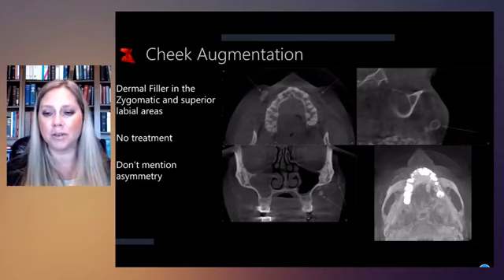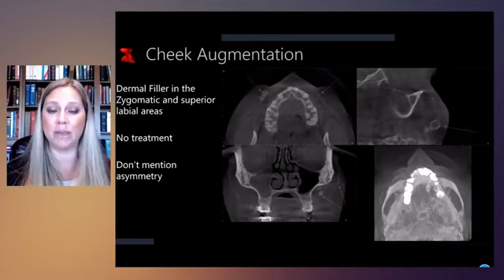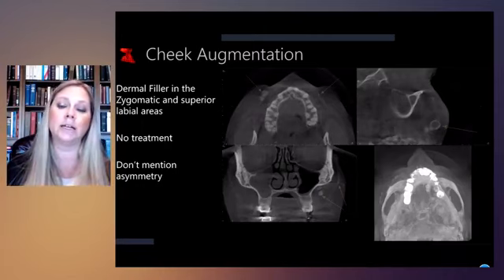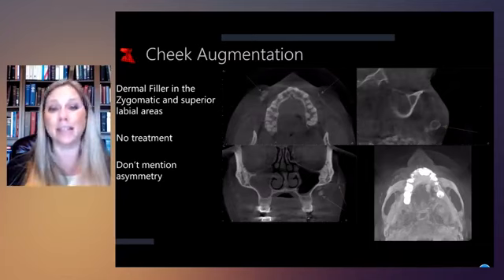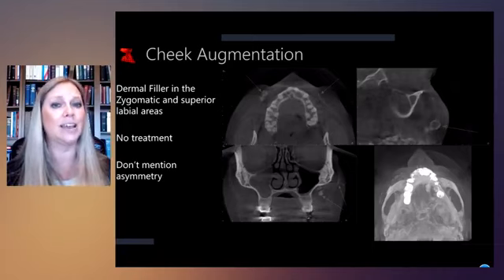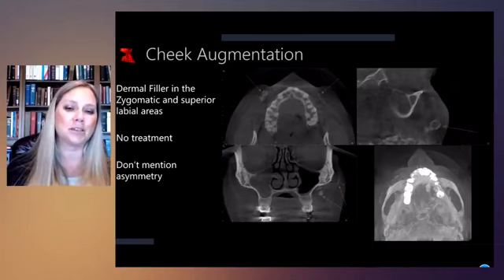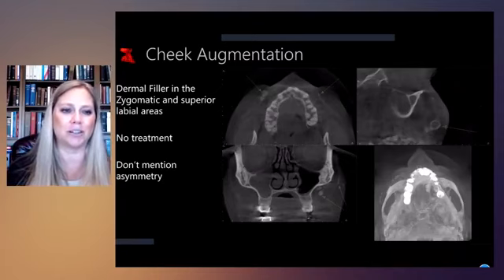Interestingly enough, we've had plastic surgeons come to our Radiology Academy meetings, and they do want to let us know that, yes, while we see them and we know what they are, you may not want to let the patient know that they're asymmetric, because that's the reason they had plastic surgery or they had some type of dermal filler placed in the first place. So that's kind of always fun to find, and usually the patients don't necessarily share that.